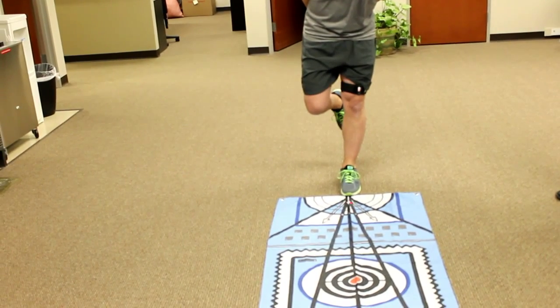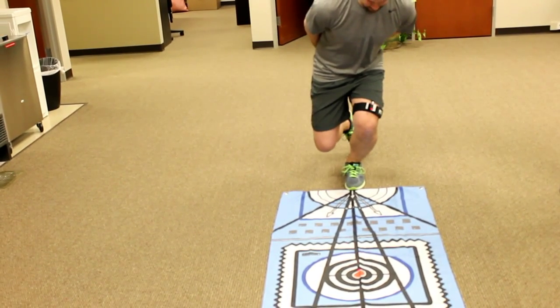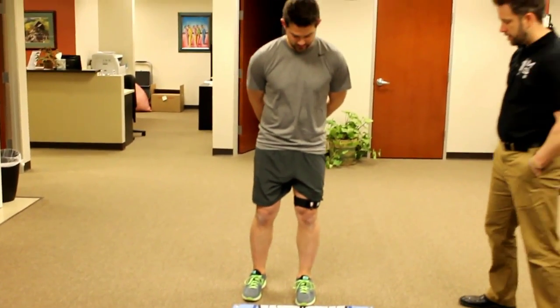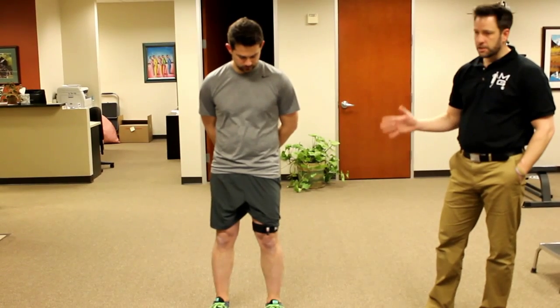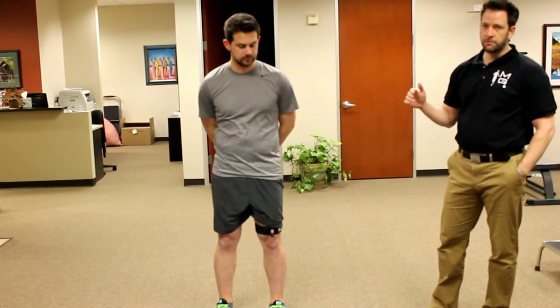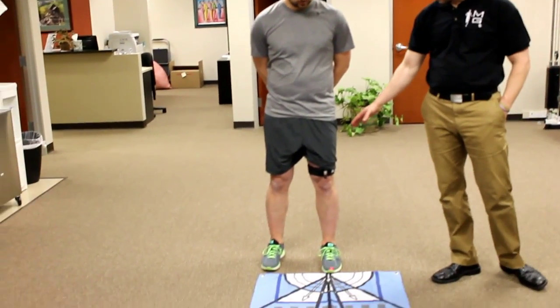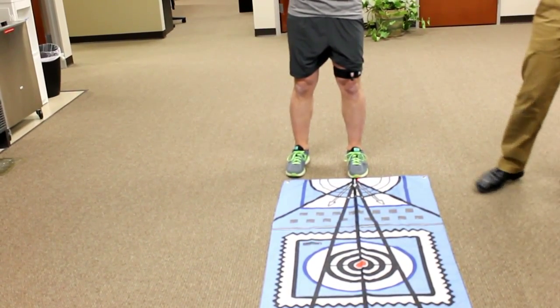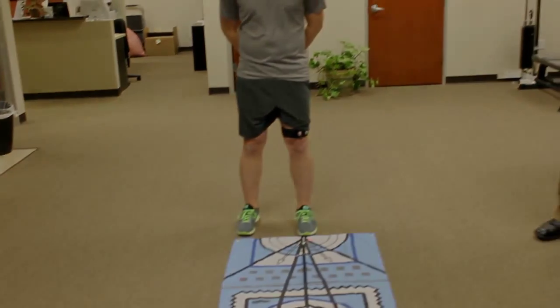Try two more there, just simulating the same action each time. That's tough to do — early fatiguing. Once we've established good patterns with Chris and he's able to consistently recreate that, now we know we have control through a large range of motion. We can start filling in the gaps of possible weakness or proprioceptive loss by working different planes of motion. This time do three or so squats going up the left line, then three up the center, and then three up the right. We want to eventually work higher level knee or lower chain athletes into that valgus with control.